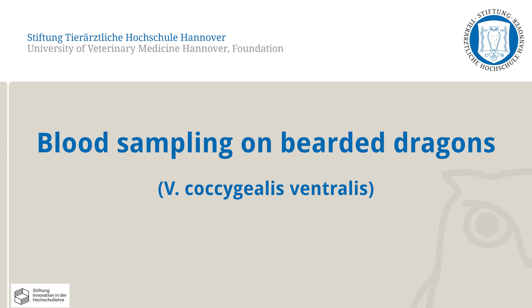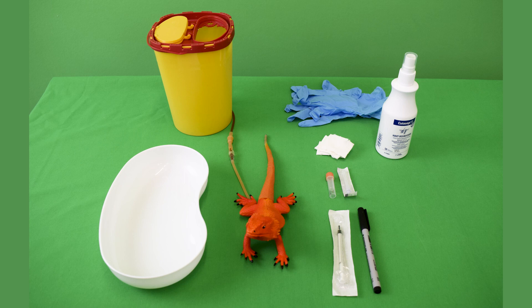Only one of the correct methods to perform this skill is shown here. Needed for this skill lab exercise are a kidney dish, disposal container, the bearded dragon simulator, disposable gloves, gauze swabs, disinfectant, a lithium heparin sample vial, a 24G cannula with a corresponding 1ml syringe, and a water-resistant marker.